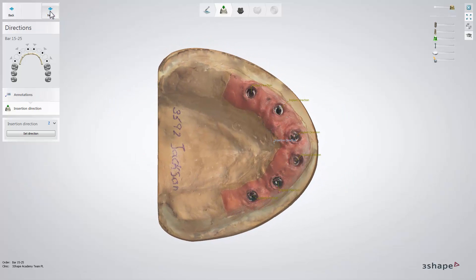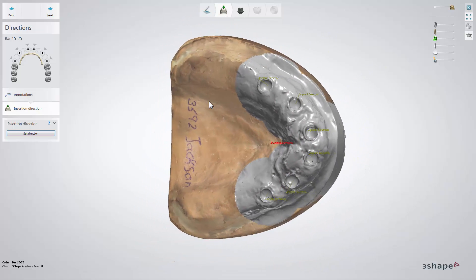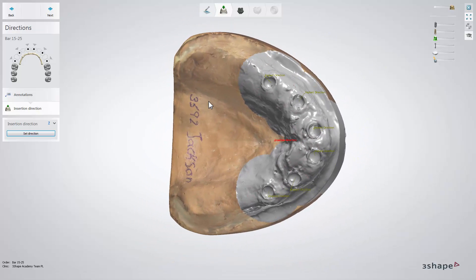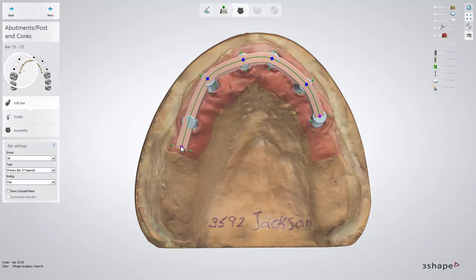An optimal direction will be calculated by the software, but you can modify it at this step. If it is moved too far for the abutments, the software will notify you with a red vector and a callout. Once the insertion direction has been set, click next and start the bar design.